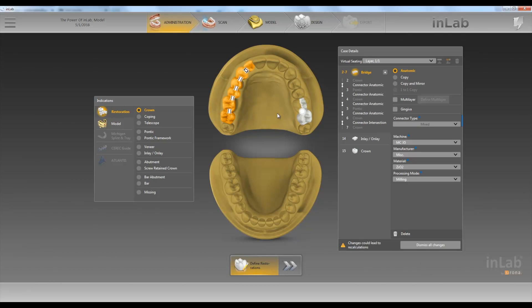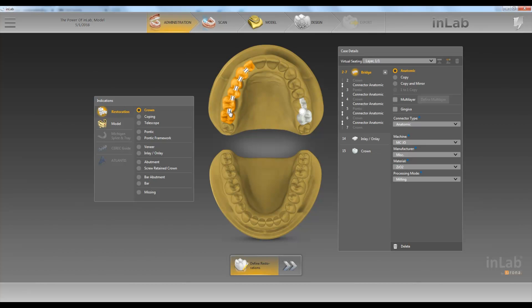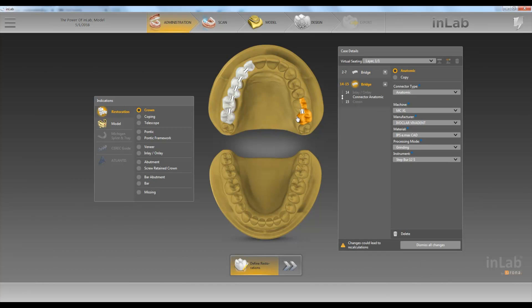If we click it again, now we have an intersecting connector here and anatomical here. An intersecting connector is a connector where the two are touching each other. If we have no connector, then that means this is going to be a single and this is going to be a bridge. For this case we'll have them all anatomical, and over here we have our inlay, onlay, and crown — they do not have a connector, so they are single units.